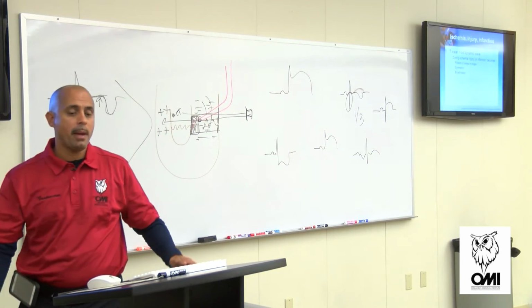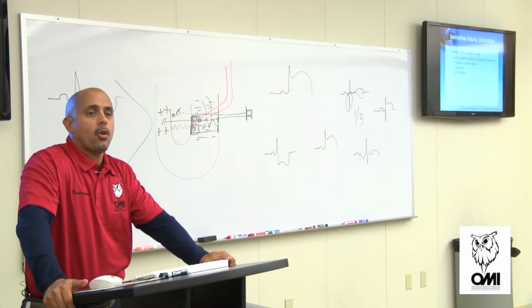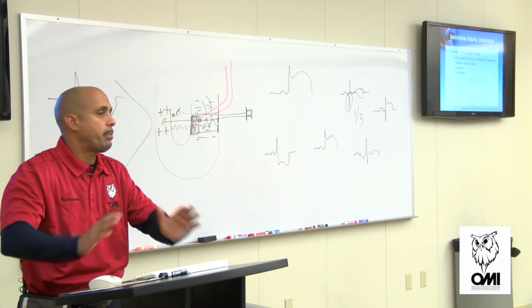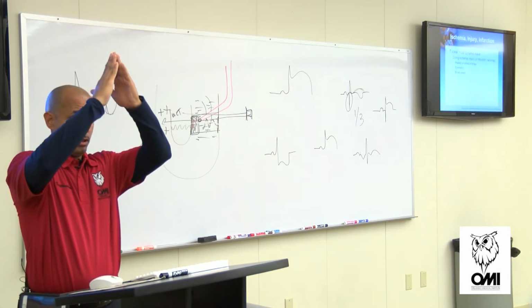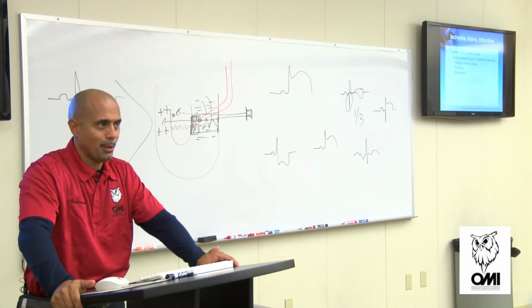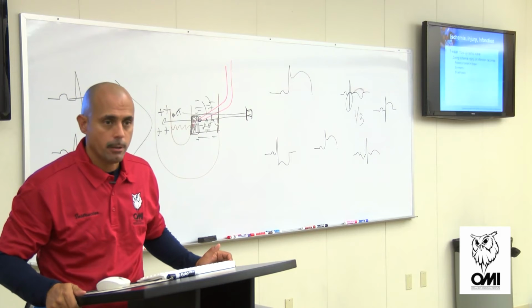And as I mentioned earlier, patients who are having MIs, especially in the anterior wall, they'll normally have what's called a hyperacute T wave. It's not a syndrome, but a very peaked T, and that happens within the first 5 to 30 minutes of the onset of symptoms. So a high, acute, suddenly peaked T wave could be a sign of an MI. All right?